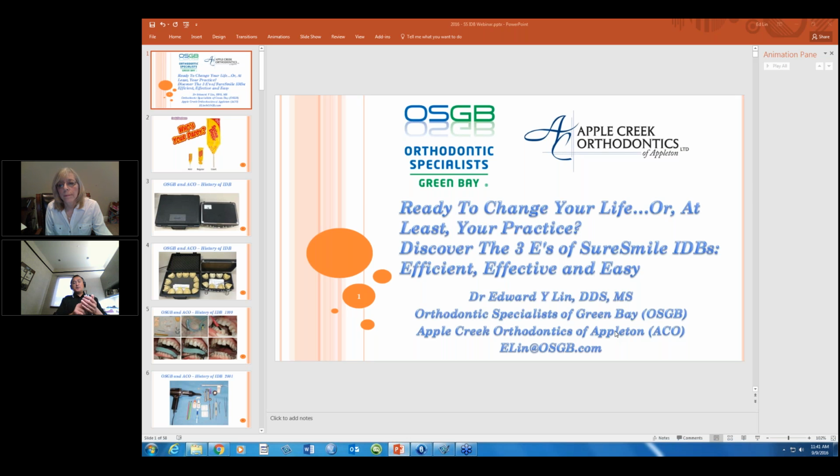And I think that's an experience issue, and we talk with the assistants about that after we do one of the indirect bondings, because if there's too much, you will have a ton of extra flash. But again, remember, they're going to take that Opal Seal cotton applicator tip, and they're going to go from the mesial, the gingival, and the distal, and they're going to clean all that up. So the majority of the flash is going to be on the incisal and the occlusal. Okay, so it's a lot less than conventional indirect bonding.